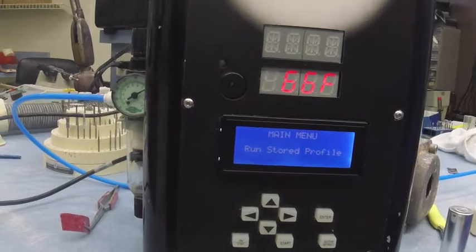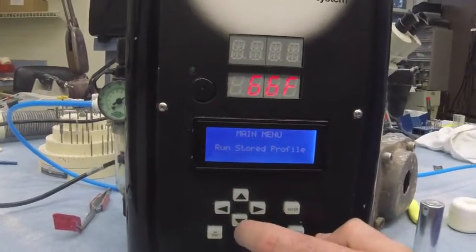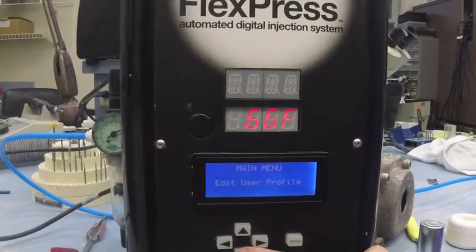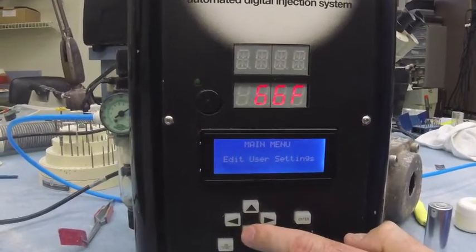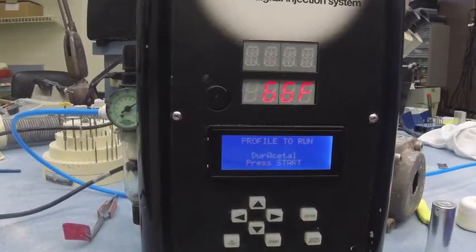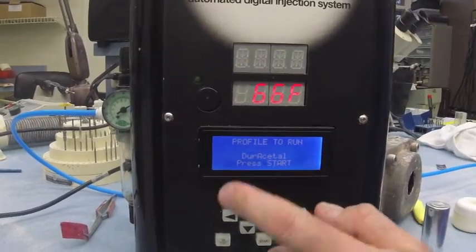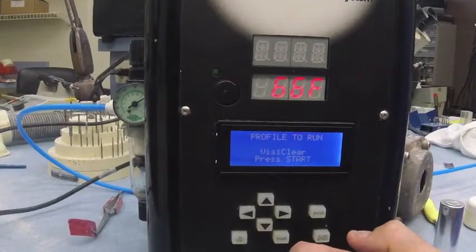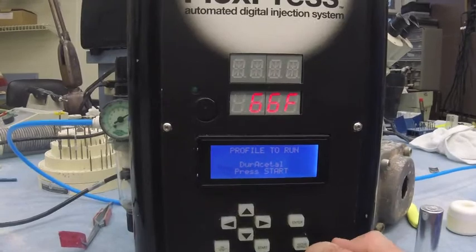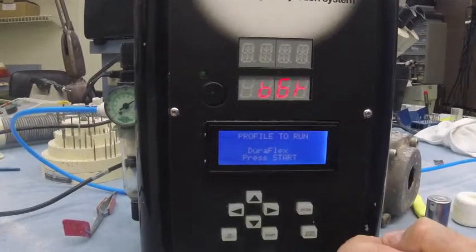We have our main menu up. We have run store profiles, run last profile, edit user profile, and edit user settings. What we're going to do is run store profiles. All of your FlexPresses when you receive them come with Duracetal, Duraflex, and VisiClear already pre-programmed — all the times, temps, everything's in there. So let's say we're going to do a Duraflex.